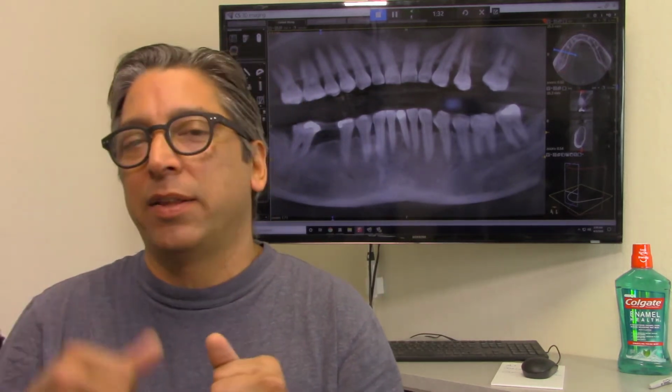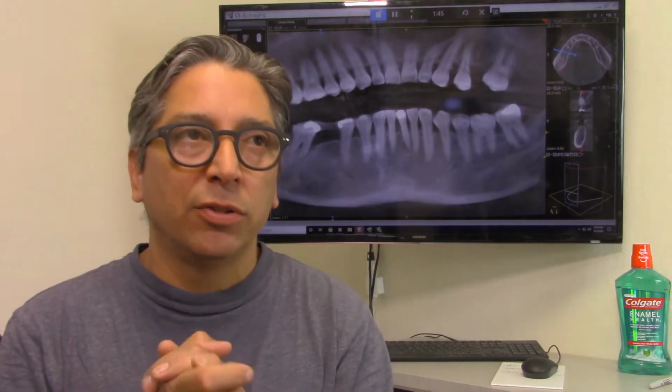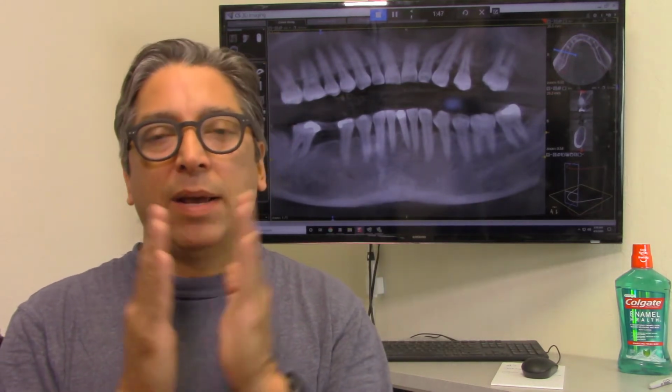So, of course, dentists always want to see that people care about their teeth, that they're going to do something, that they're going to be proactive. So this case is a single implant placement. We're looking at what I call the primary chewing area or the primary occlusion area, and we're replacing the lower right side. But let's look at the upper left side because that's where things started.